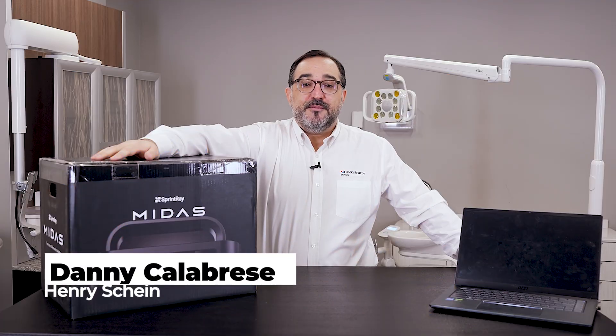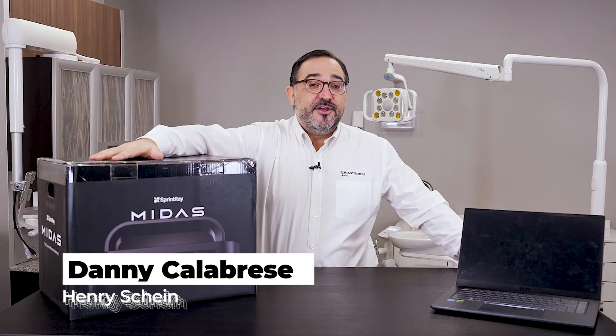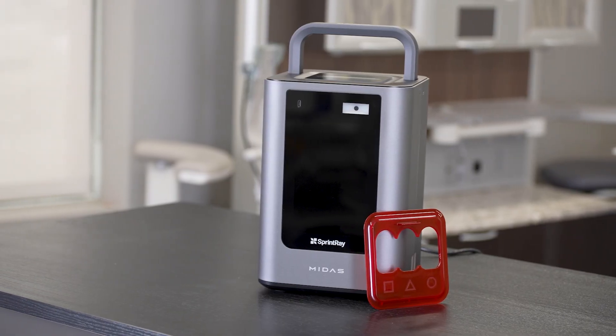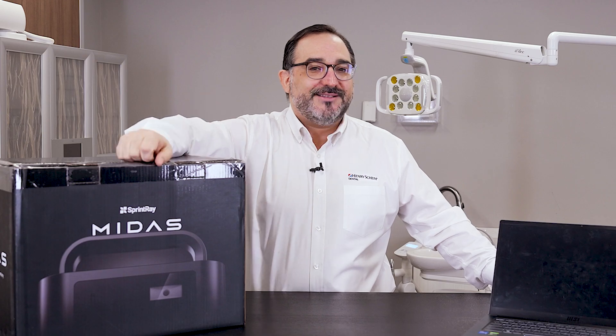Sprint Ray is revolutionizing the game with its brand new printer, the Midas, featuring exclusive Print Press technology. Today we're gonna be unboxing this and printing a crown on this episode of Henry Schein Unboxed.